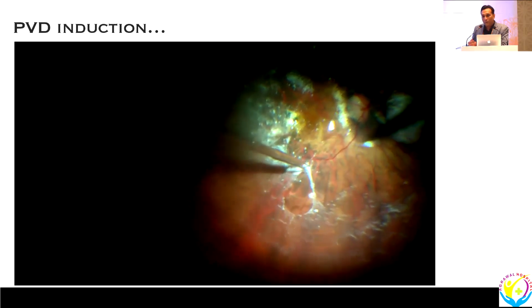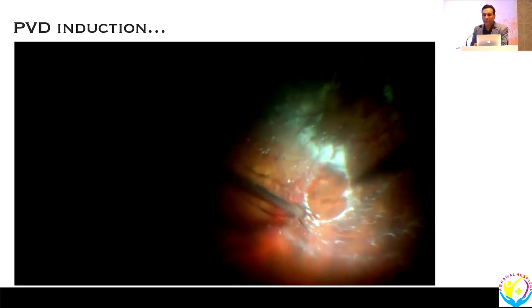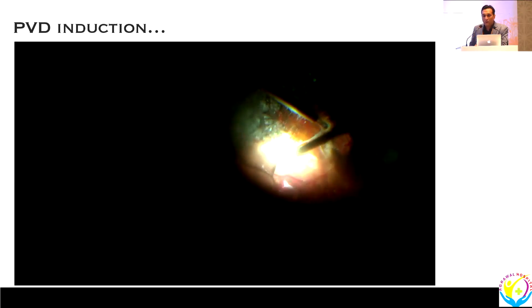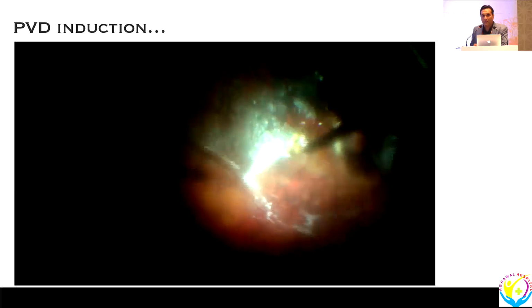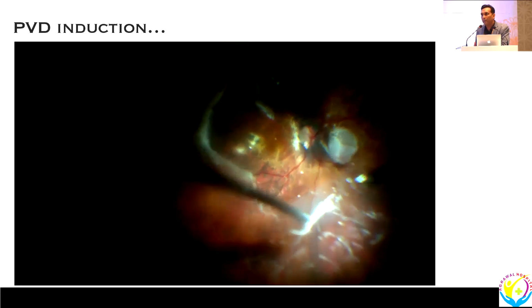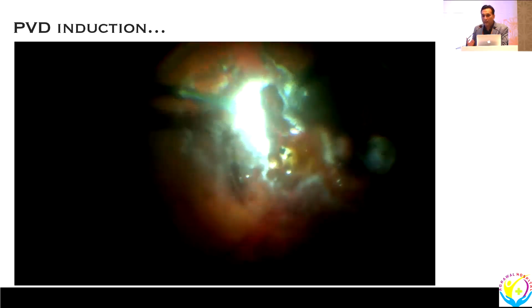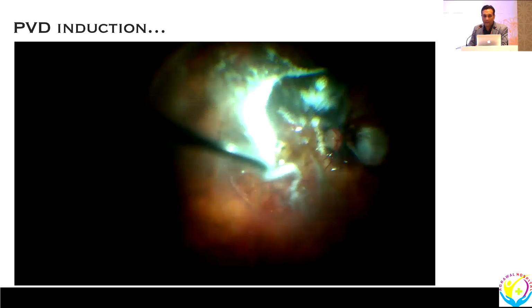If the length is around 28, 29, this technique works fine. You inject some PFCL after staining. You make a small cleavage plane on the hyaloid, and you widen that hole in the hyaloid. With blunt dissection with the light pipe, you enlarge that cleavage plane, and the whole PFCL bubble goes inside the subhyaloid space. It's a very atraumatic and reproducible technique. Then finally, you fill more PFCL in that well, and that cleaves the hyaloid till the mid-periphery, and that works fine in most of these cases.